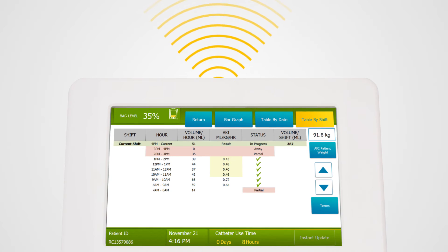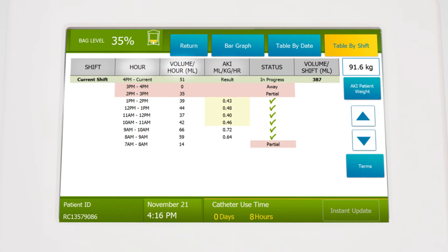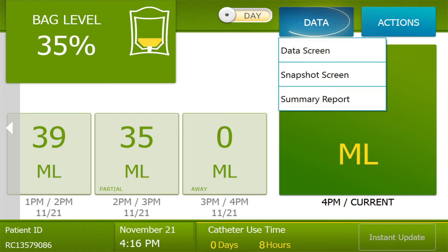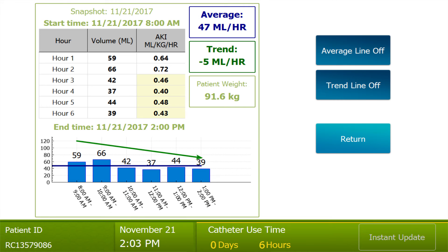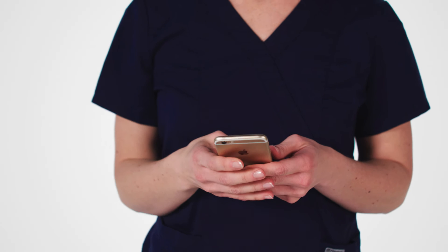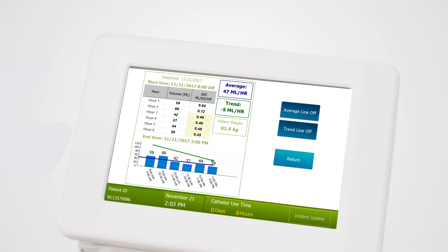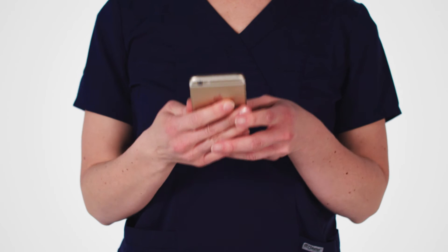Once Sensica UO data is transmitted directly to the EHR, the urine output information can be configured into various reports. There is one built-in report under the data button called the snapshot report. This report shows the past 6 hours of urinary output, updated every 15 minutes, with an average and a trend line. If your facility permits, this information is formatted so that you can frame it with a mobile phone camera and text it right to the doctor.